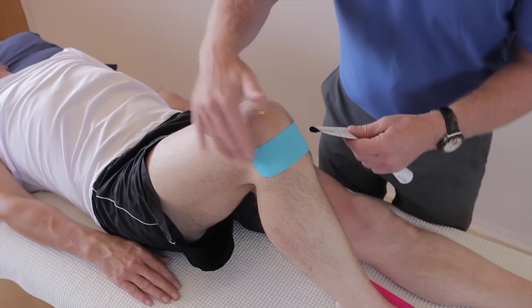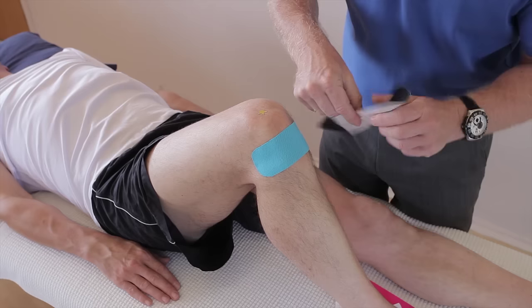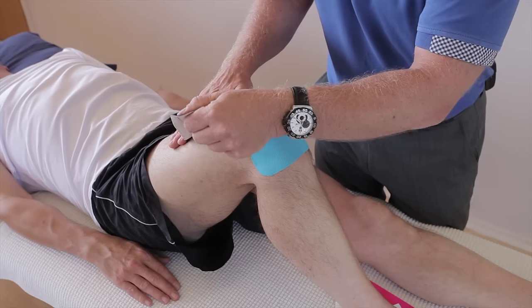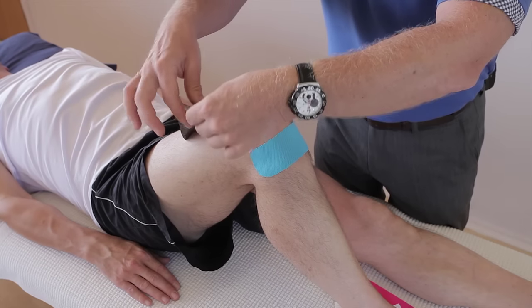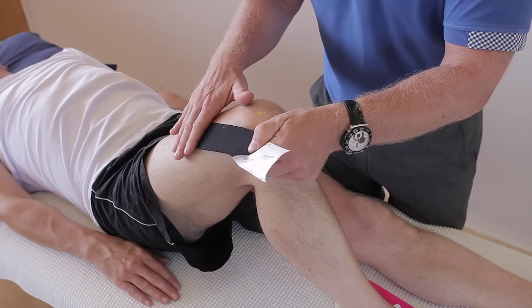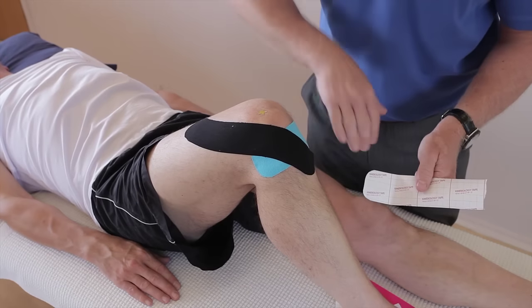The second application is going to go from the superior part of the knee, come round lateral, and finish on the tibial tuberosity. Split the first square and apply that around the quadricep expansion area. Split the tape by holding and pulling, and that will just break off the back naturally for you. Peel up back to the first square. With two fingers, take it to 100% stretch, then reduce to 50 to 25% — 25% as it comes towards the patella, 50% stretch as it goes past the patella, and then finish on the tibial tuberosity with no stretch.